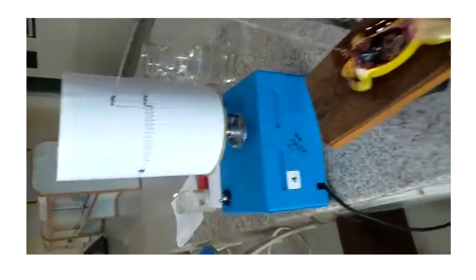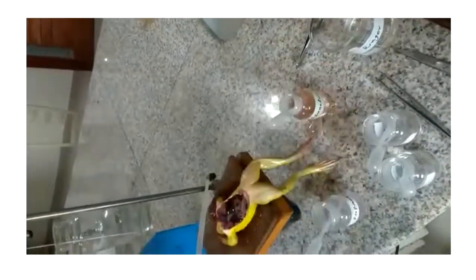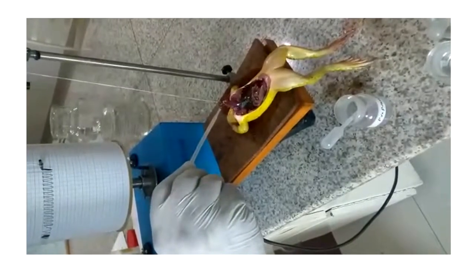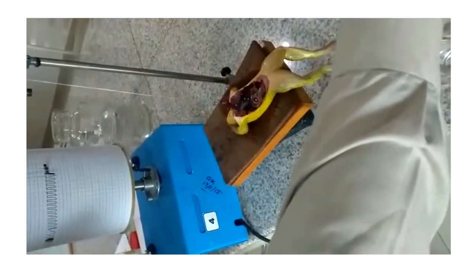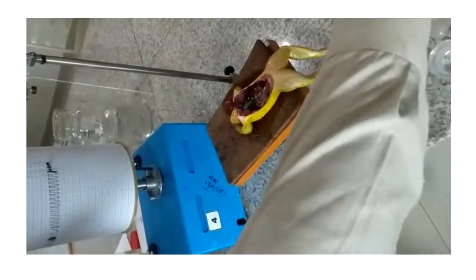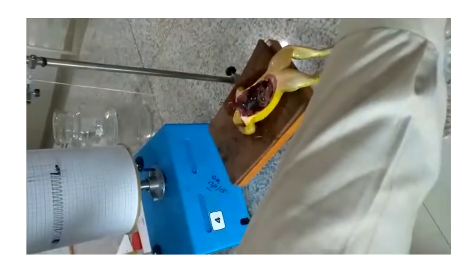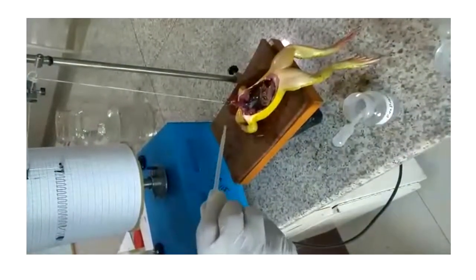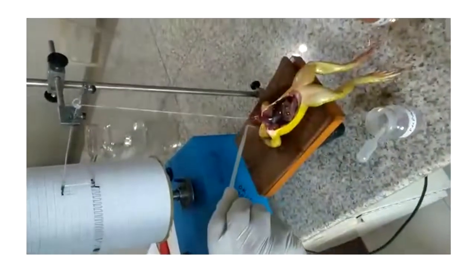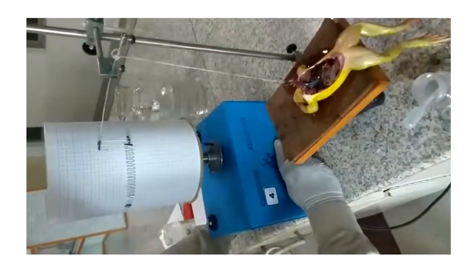Now we'll wash this with Ringer thoroughly. Now we'll take normal reading again for 30 seconds.